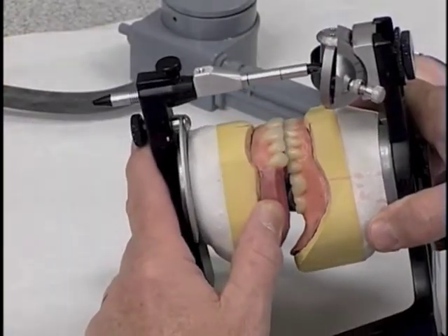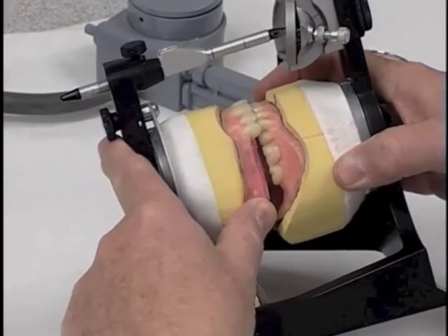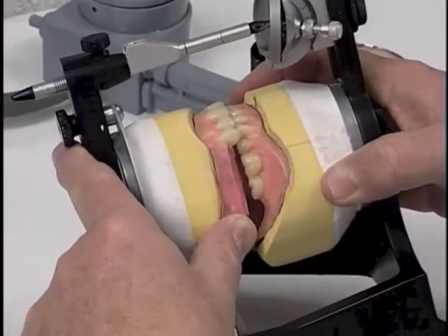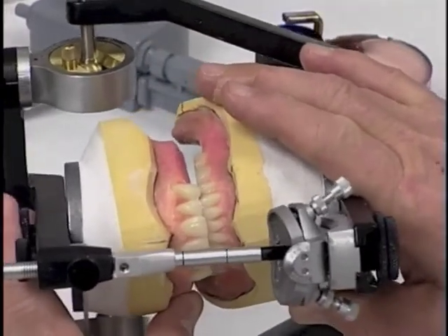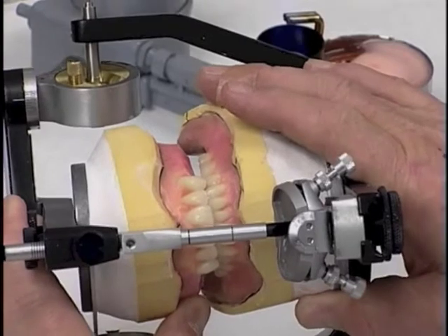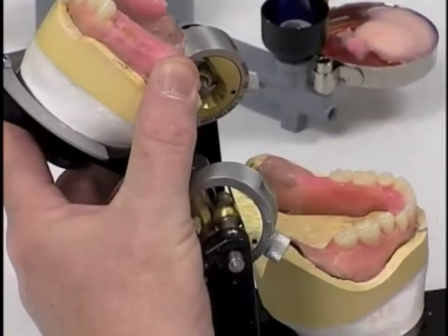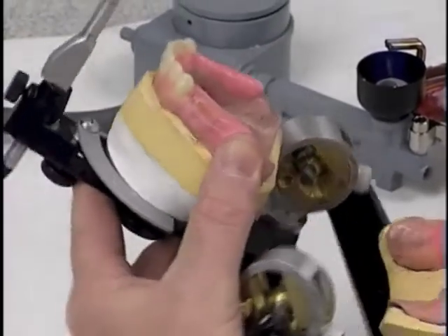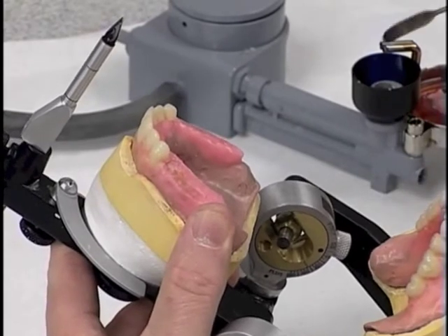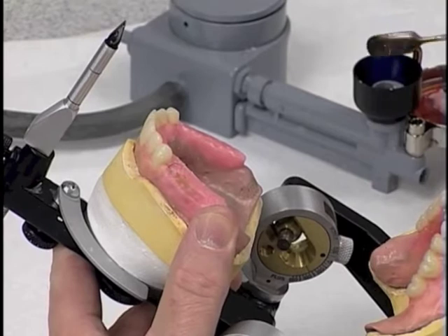posterior teeth. In arranging the maxillary posterior teeth, I usually go ahead and remove a good wedge of wax back to where all those posterior teeth are going to be, as I've done here. I've done it on both sides. Now I don't have to remove wax one tooth at a time. So we're going to start arranging the maxillary posterior teeth, and we're using one second premolar and not using the first premolars as we did on the mandibular arch.